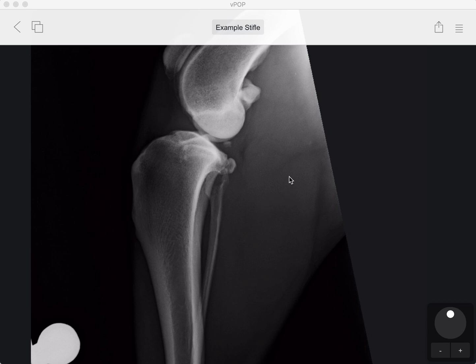In this video we're going to be learning how to use the circle tool and the common tangent method for measuring advancements in TTAs.